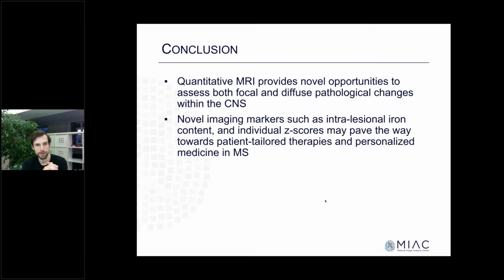Yes. Okay, great. His next question is, do you have 3T QSM protocols available to show the RIM effect? Yeah, this is achievable. At 3T, I don't have them here yet on this PC, unfortunately, but this is possible. It's even, with a lot of caveats, achievable maybe at 1.5T, but not at so good quality. But at 3T, I think this is feasible. You will not reach the same sensitivity as at 7T for sure, but you won't miss a lot of rims at large lesions, at least. Small lesions may be a problem.